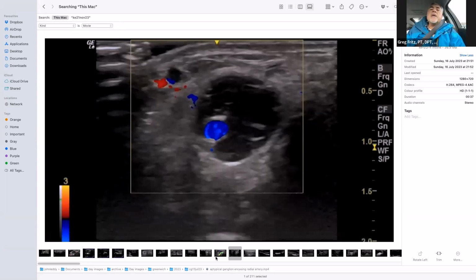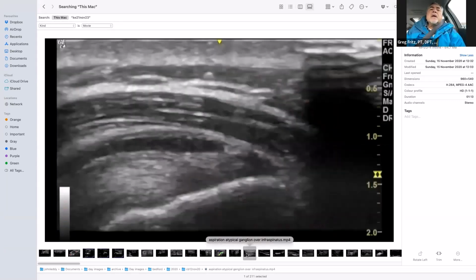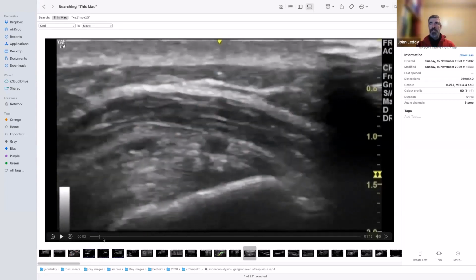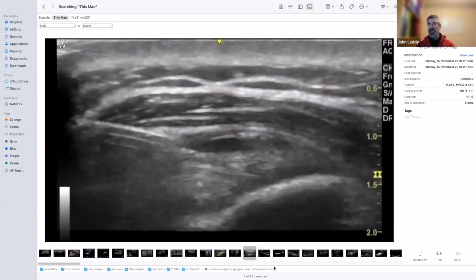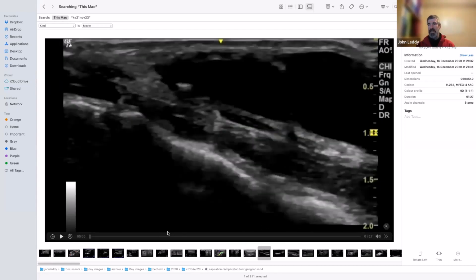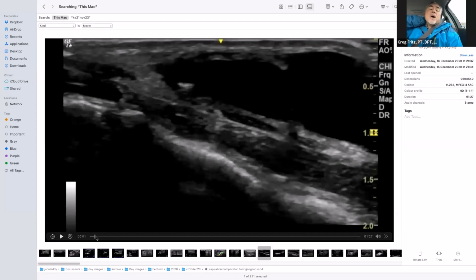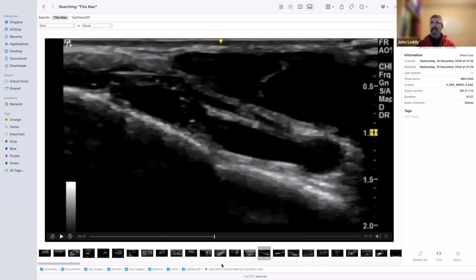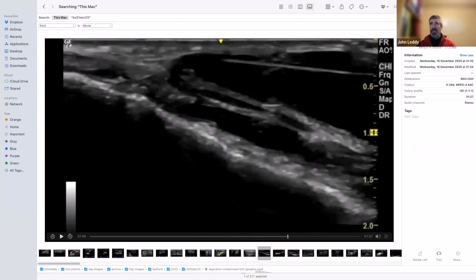Wow. Now, would they find it hemodynamic if they would have just put something on it, or with that large a structure, is it not showing flow? They often don't show a lot of flow because the velocity of flow is very low in them. So what do you do? Do you push up and down on it and try to make the debris move? You do that, but it's not always very successful.